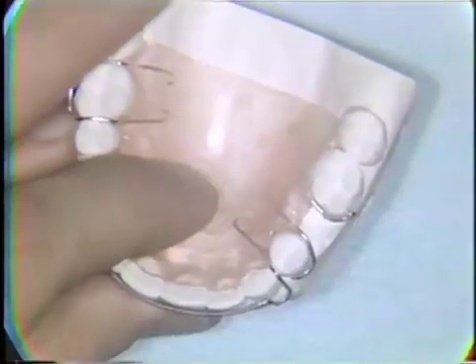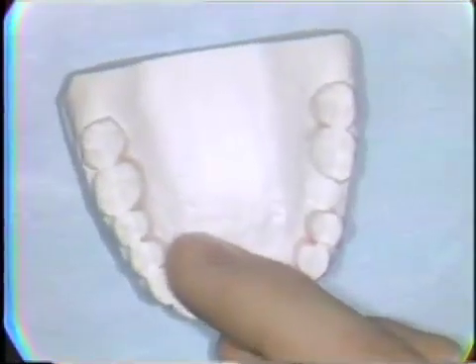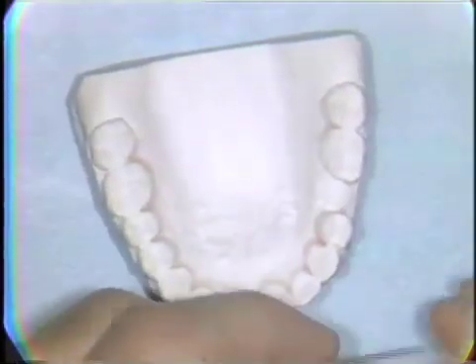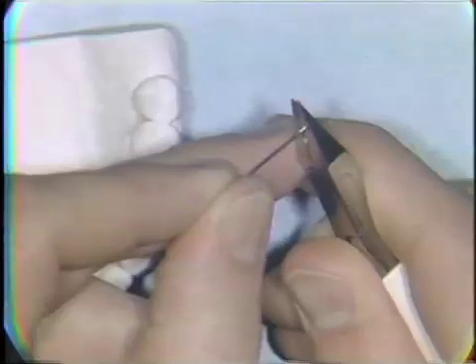Circumferential clasps are usually constructed from .030 stainless steel wire, although they sometimes are constructed of heavier wire, depending on the need of the particular case. The first step is to bend a small curve in the end of a short section of wire.